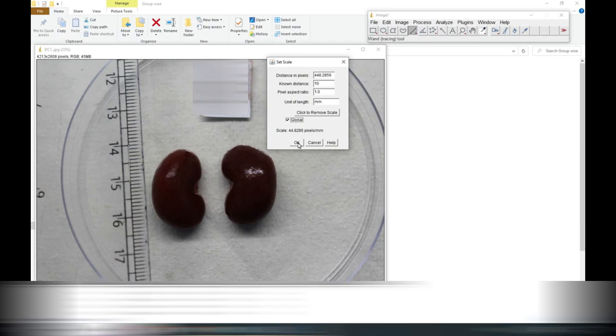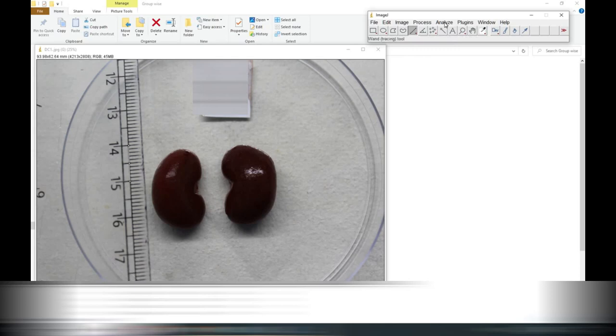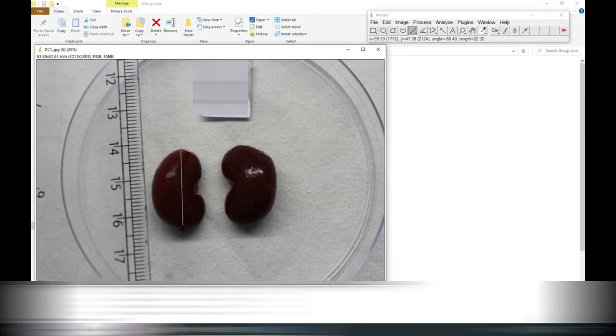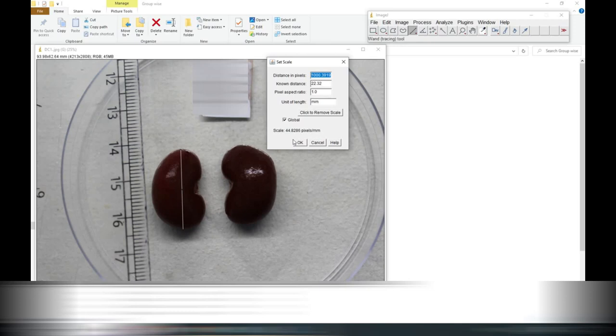We will choose here our cursor and select by dragging up to the length of the kidney. We will choose kidney measurement and you can see the known distance, the known distance in mm. You can see that it is changing every time.